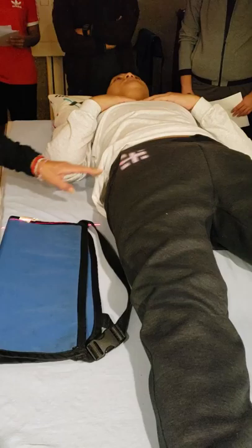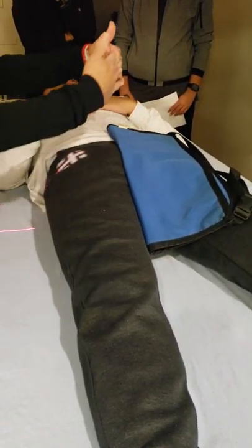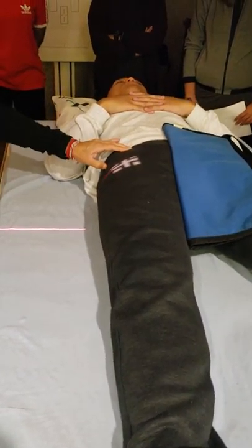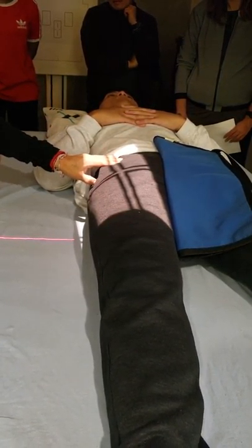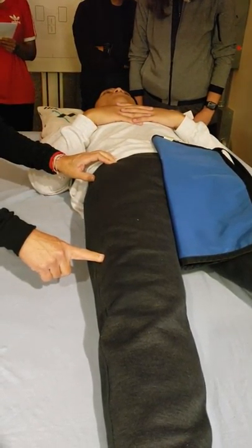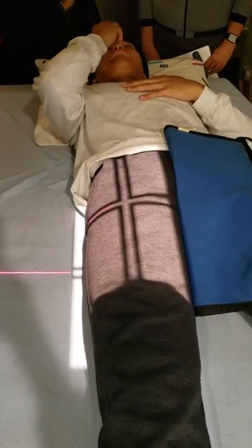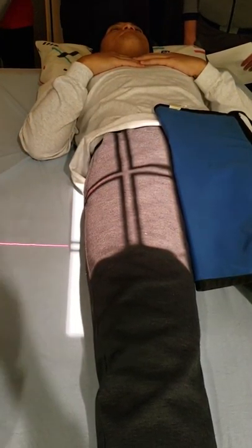From now on, we're going to be finding our ASIS — that's going to be the landmark to begin with. Notice how I place the shield; it goes sideways slightly. You have to find your ASIS and open up fully 14 by 17 lengthwise — that's your 17-inch dimension. Then you're going to collimate to the midline of the body. So I find my ASIS, start from there, and let it go all the way down the 17-inch length. I open up a little more to get the midline of the body, the MSP, and then place my marker right where the light corner ends.